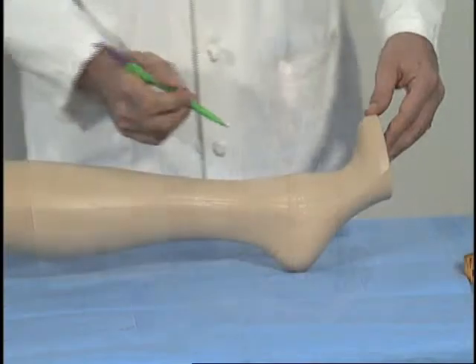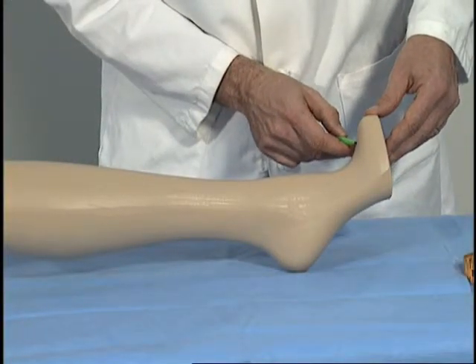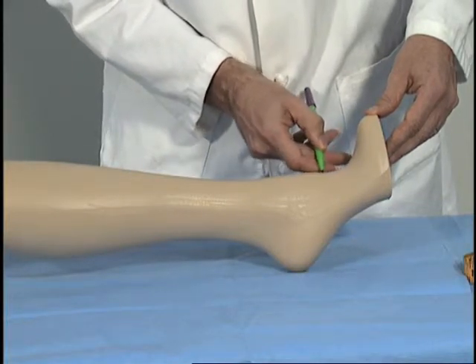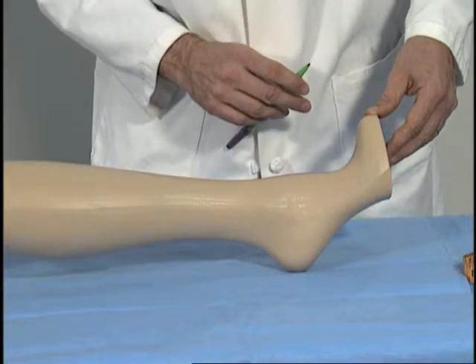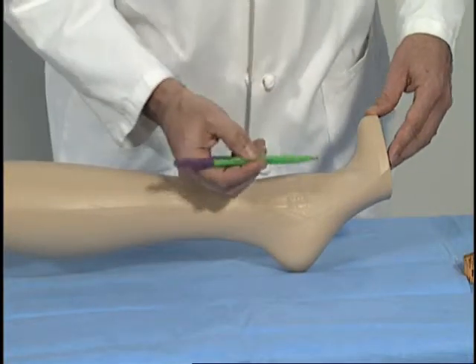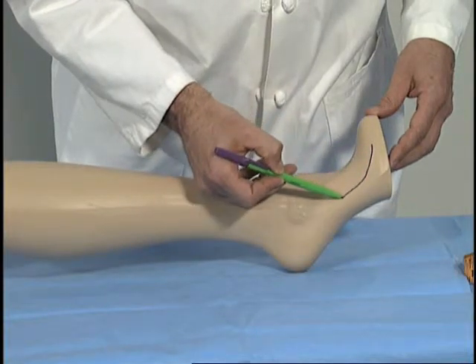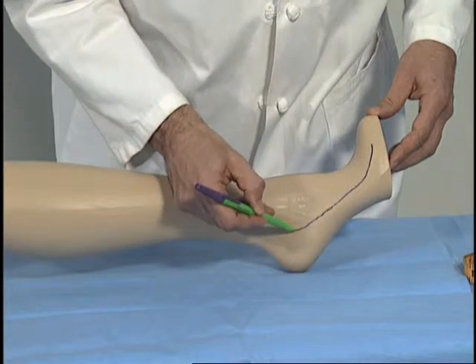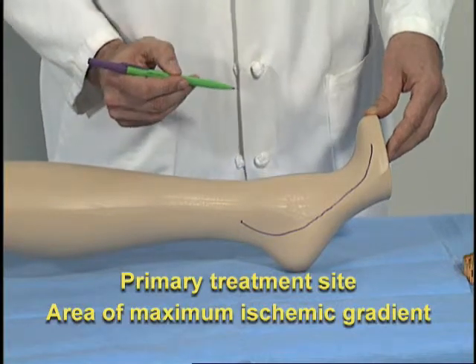So we'll start with the dorsalis pedis, and we'll trace up on the dorsum of the foot, again with ultrasound guidance if necessary, or just moving off the tendon. Then we will also trace the posterior tibial distribution across the plantar aspect, trying to work on the tarsal branches and around the ankle as our primary site of treatment.